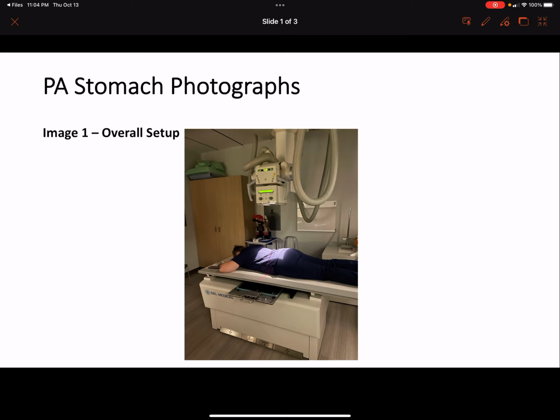I then asked her when her last menstrual cycle was to make sure that we didn't have to do a pregnancy test before we started the series. Once the patient verification was complete, I had the patient lay on the table in the prone position.